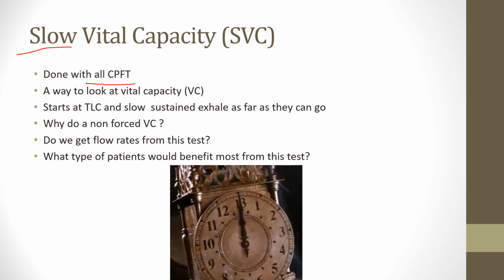We do it with every complete PFT. And a complete PFT is where we take a patient into the pulmonary function lab, and hopefully you get to experience this in school and or outside of school. We take the patient into a pulmonary function lab, and we have that big body box machine like you've seen in the other presentation, and we have the patient breathe on it, and we do all different types of tests, and that includes the slow vital capacity. Here's the thing, we also have patients in the hospital at the bedside, and most of the bedside machines that you can take into the hospital rooms include the capability of performing a slow vital capacity as well.